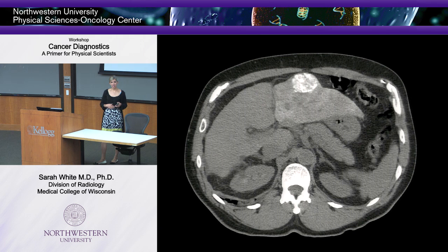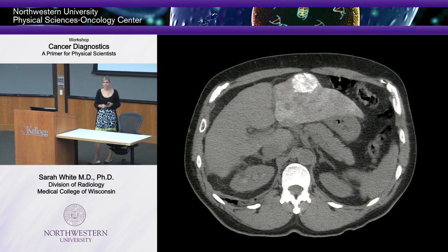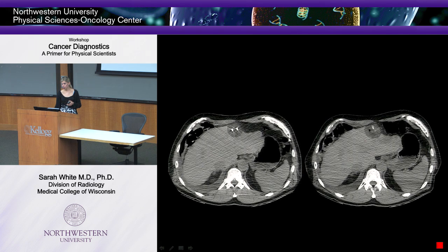Okay, so because that tumor, you can see how close it is to his skin. It's right here. So I decided I didn't want to cook it because I didn't want to cook his muscle, because that's probably going to hurt a lot, right? You cook your muscles, your ab muscles, that probably wouldn't feel good. So you freeze it, and freezing doesn't hurt as much as cooking. So we put our probes in, and here you can see our probes.